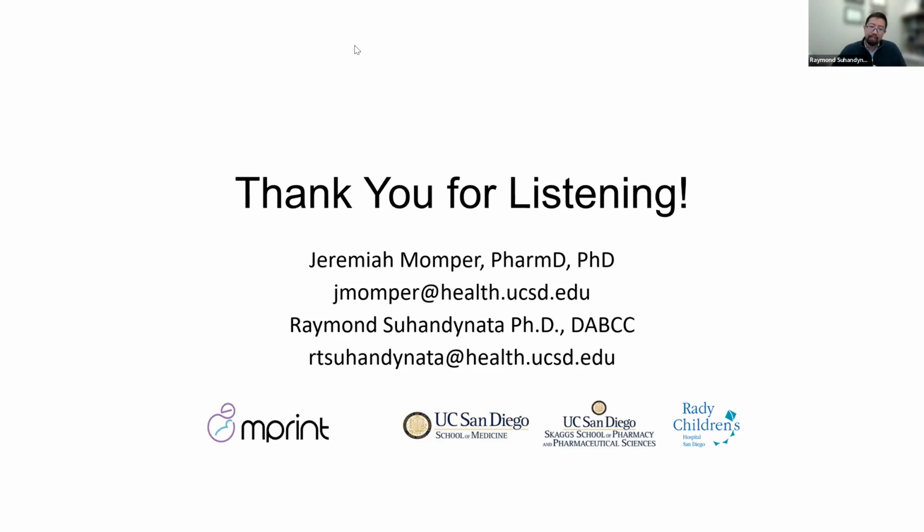So again, this kind of dives into that fit for purpose. Are we just doing research? No medical decisions are being made. If not, then you can have a discussion with that lab and you can do some sort of pre-validation rigorous experiments to show that maybe you don't need to do a full validation. It's still valid within that linear range. So I hope that answers your question.